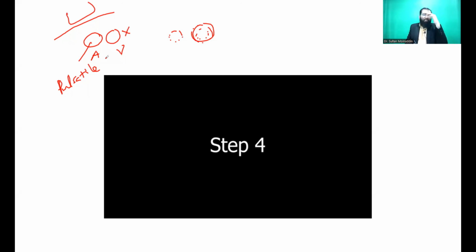Number two, ureter is not seen unless it is dilated. Remember, ureter is seen only if it is dilated. Of course, ureter is not pulsatile. And any ultrasound machine always has a provision of a color box. So you can always put a color box and see if it's artery, vein or a ureter. Ureter will not show any color flow, whereas artery and vein will show color flow. Okay. Chalo, hope that solves the question.